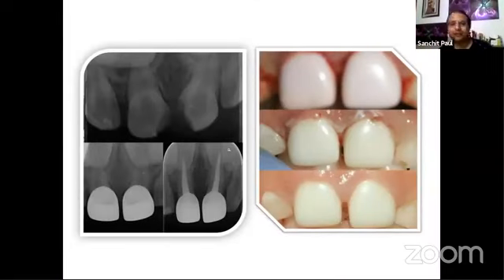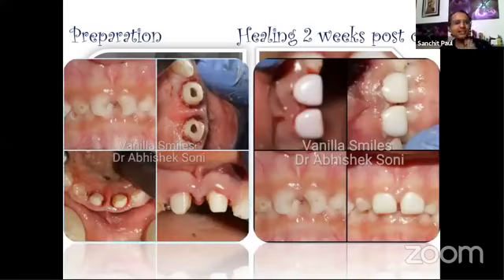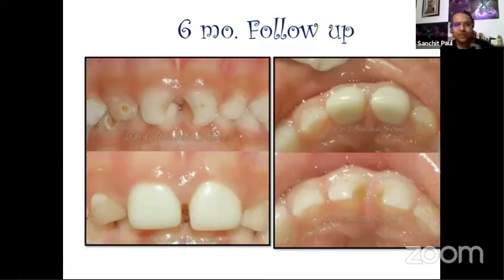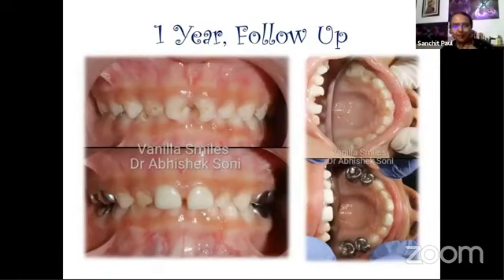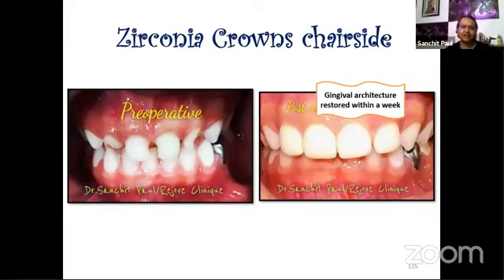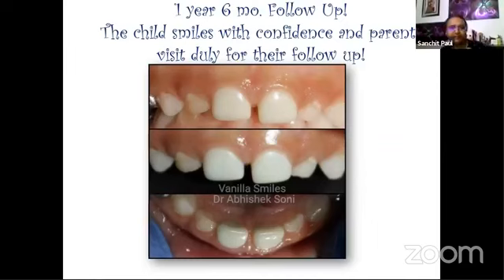And these crowns not only promote stable treatment, but also highlight the overall psychological benefit, because see, these are all 3 year olds, 4 year olds. The only thing they remember is their teeth, which are mutilated, which are always paining, with discomfort, and at the end, everybody is struggling: the child, the doctor, the parents. Once you start using these crowns in a proper case selection way, they give beautiful outcomes. And I think the pictures are there to say. I really don't have to speak on what difference it makes.